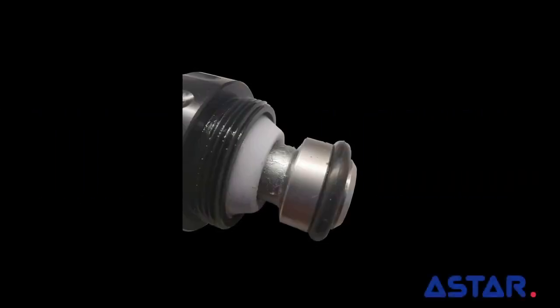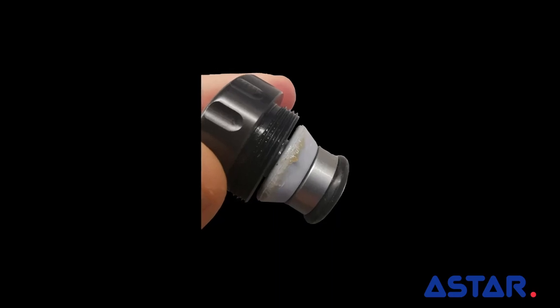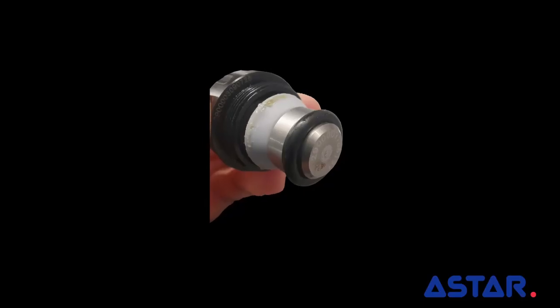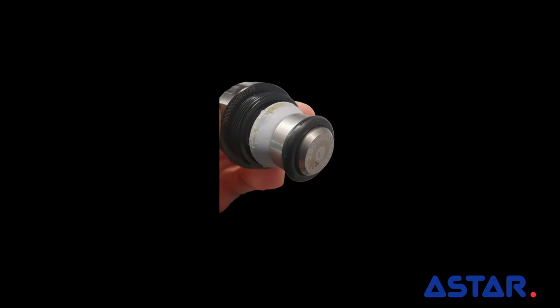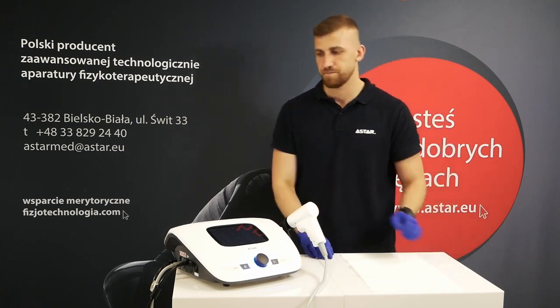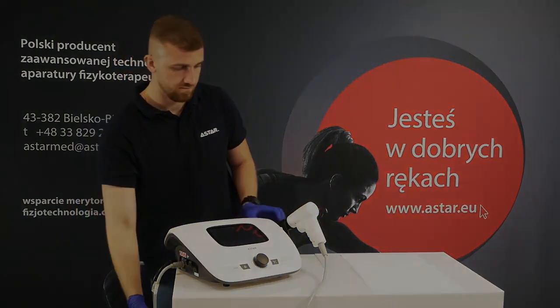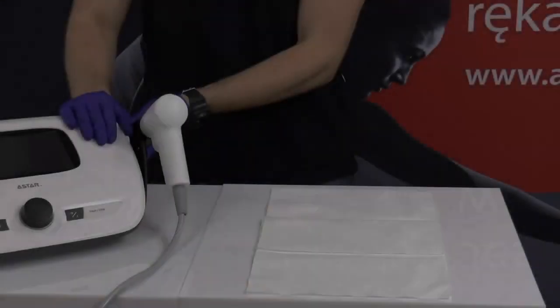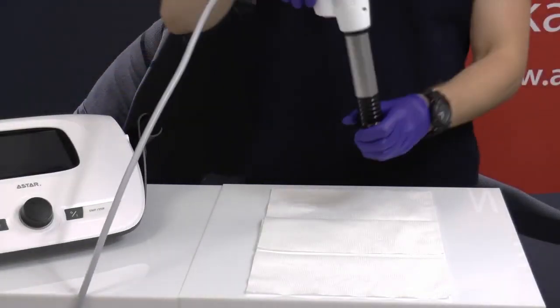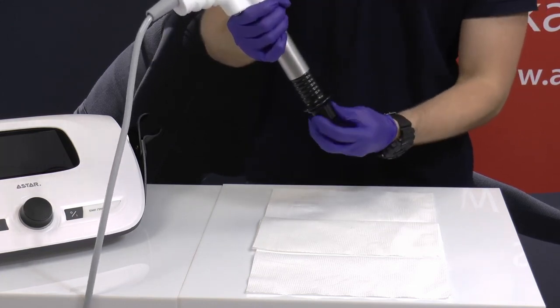All the transmitters and the applicator used during the day must be cleaned inside, as gel and other elements might have penetrated inside. Disconnect the device from the power supply. Remember to perform all the actions holding the applicator with the mouth of the barrel pointing towards the floor. This will help you prevent the impurities from getting inside the projectile system.